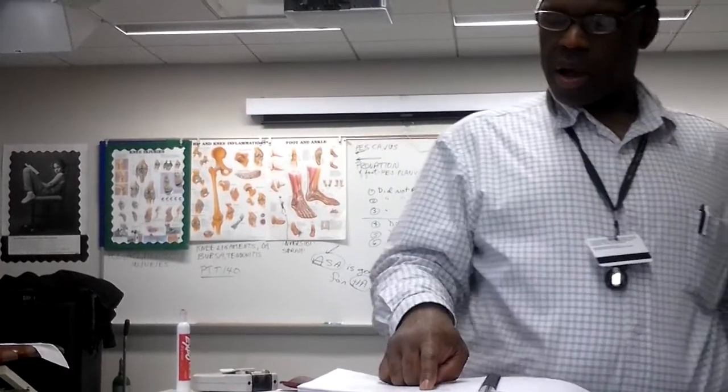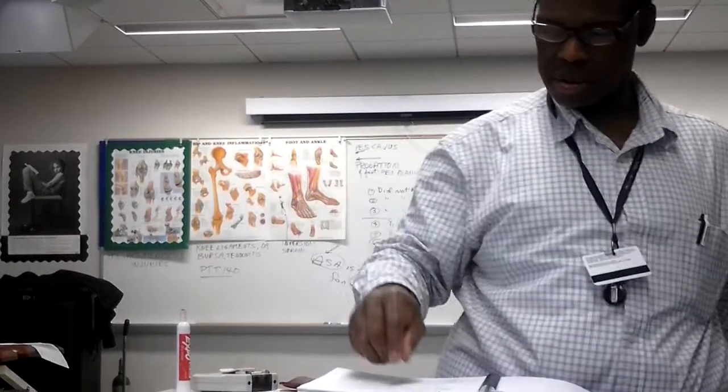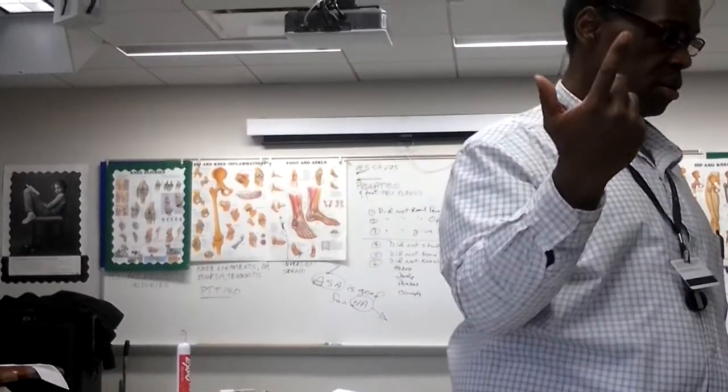All right, a twitch, page 17, number 3: 1 to 10 pulses per second, brief blips for contraction. Used for motor intensity and pain protocols to get long-term relief. However, tetany sits above 15. Somewhere between 11 and 14 or so, you get that changeover from twitch to contraction, because it doesn't say anything about 11 to 14.